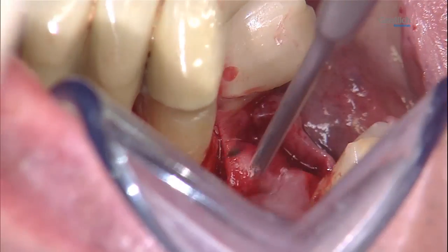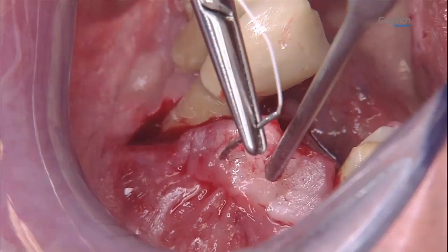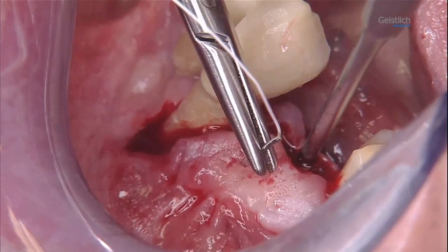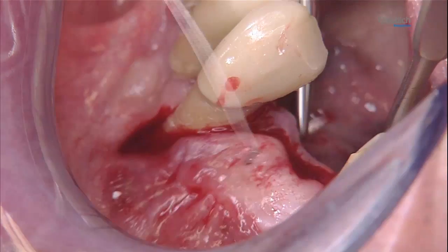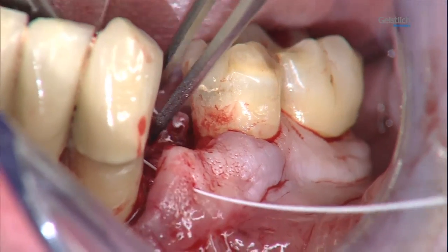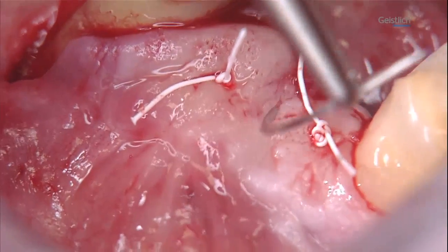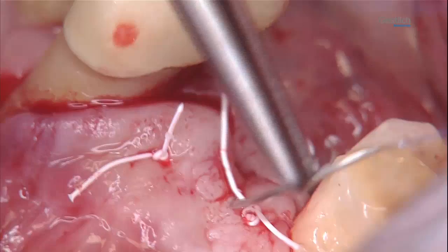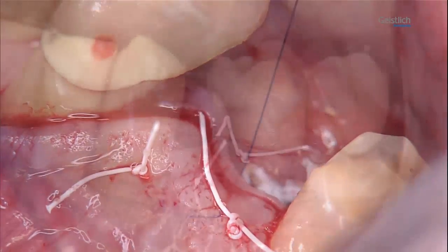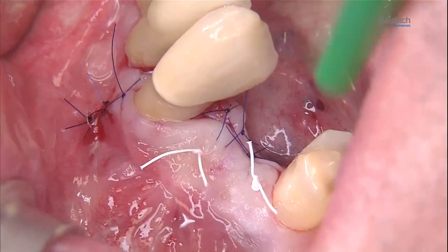The Geistlich Bio-Guide membrane is then laid over the Geistlich Bio-Oss Collagen. It covers the defect and is wetted with sterile saline. The tip of the membrane is pushed under the lingually mobilized flap. During suturing, we can clearly see the vestibular scar created during the original root resection. The surgical access is initially closed for adaptation of the flap edges with two crestal mattress sutures. For further healing, it is advantageous if the surgical area is tightly sealed with additional interrupted sutures.